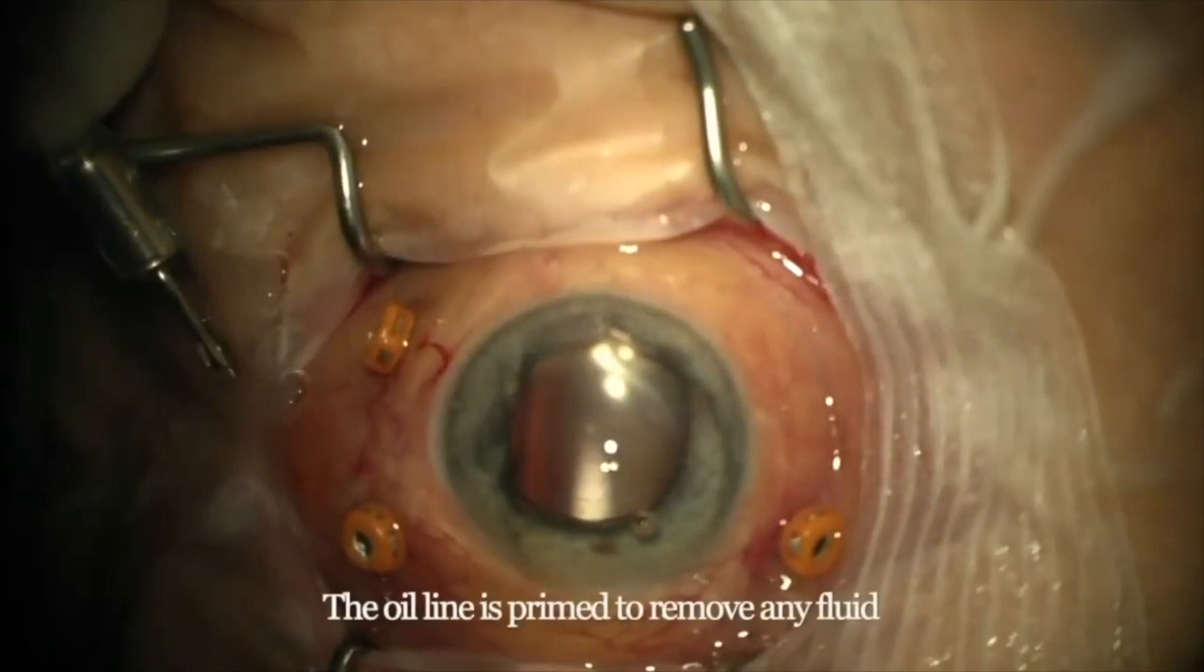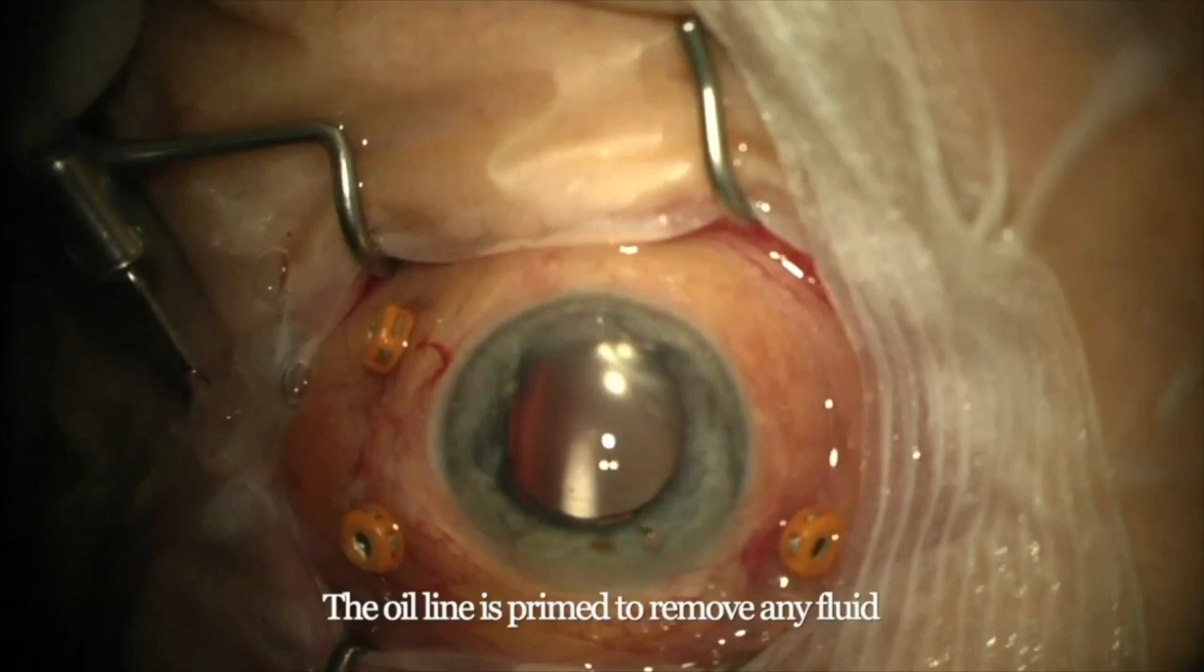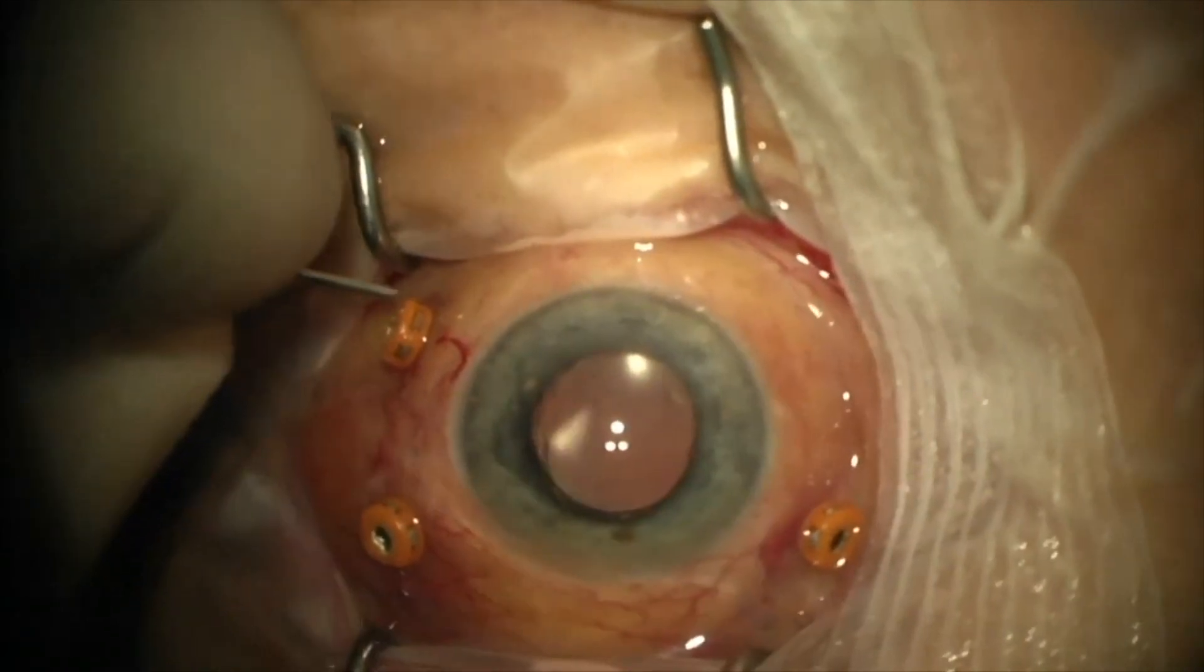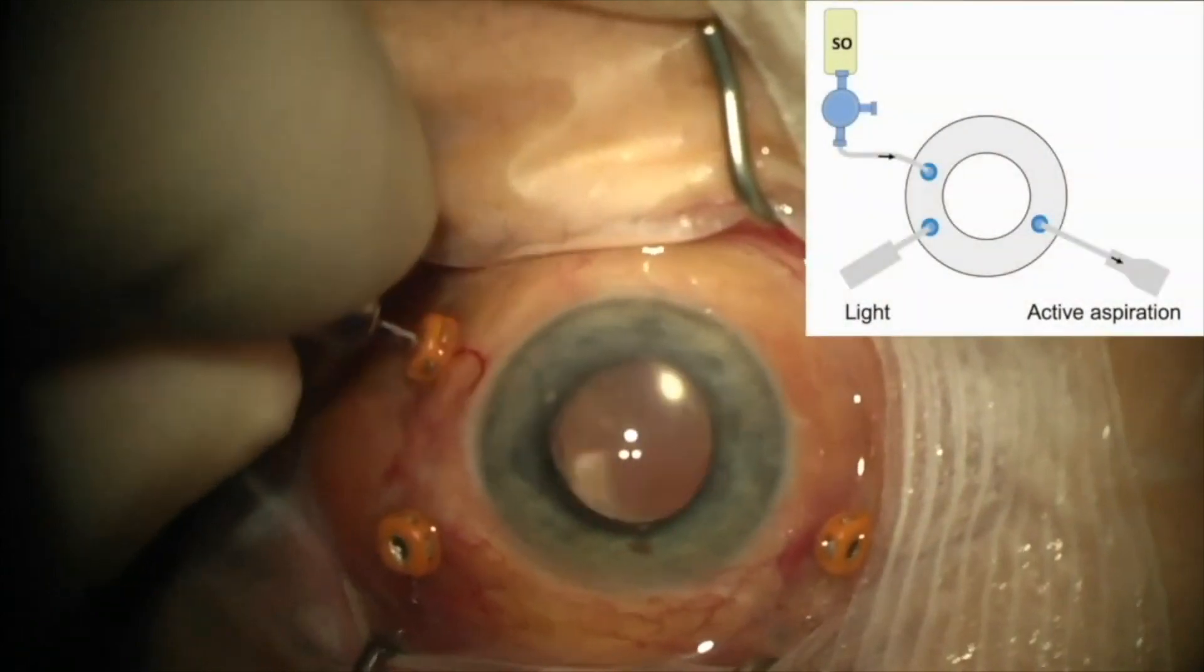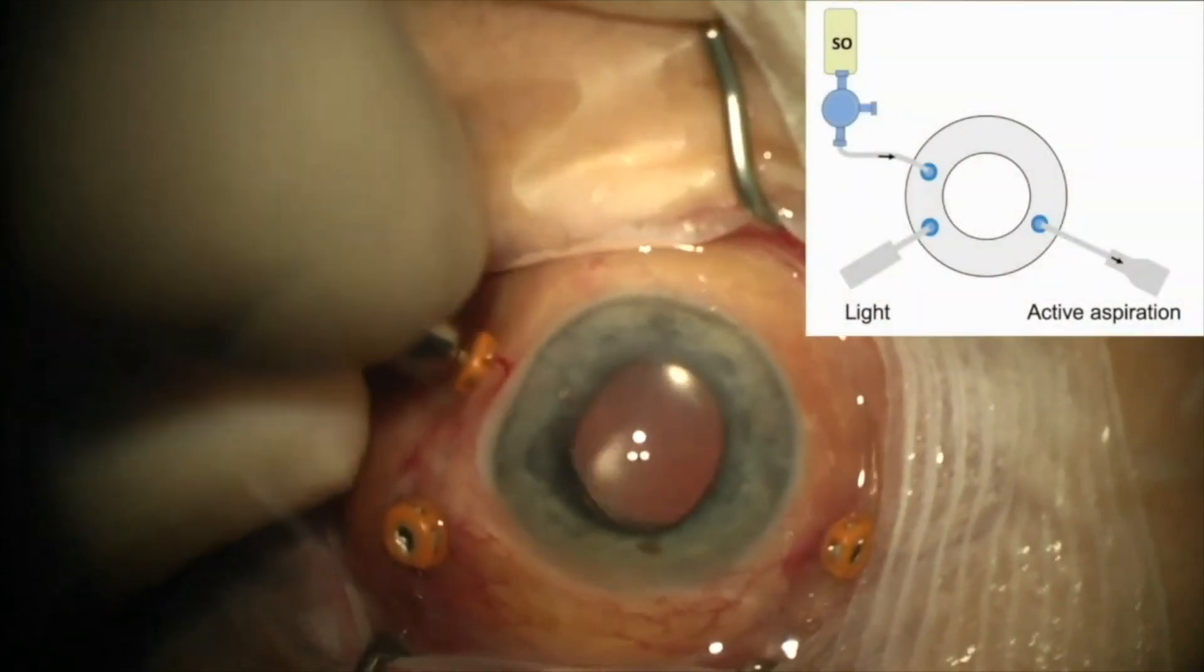We start in any silicone oil exchange by priming the infusion cannula with silicone oil, then putting back in the eye. The photograph insert shows the rest of the setup with the active extrusion and the light pipe inserted through the superior trockers.